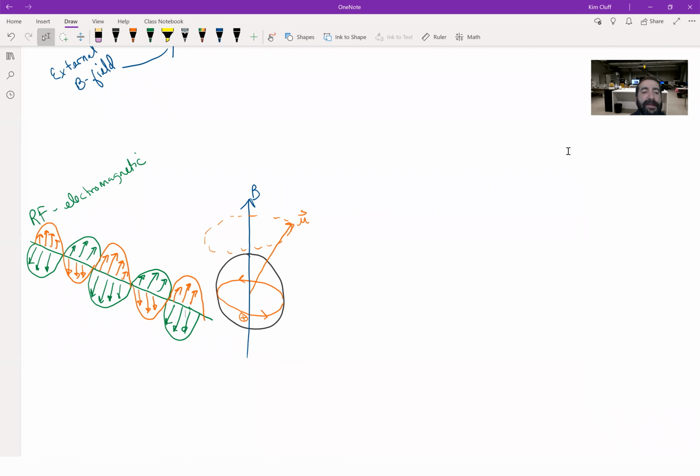But in any case, even though we don't fully understand that, we do know that light, or RF, is made up of electromagnetic fields, electromagnetic radiation, which have an electric field oscillating with a magnetic field. Okay, and it does this at a certain frequency. So there's a whole bunch of different radio frequencies.